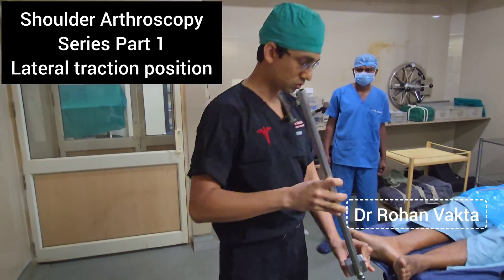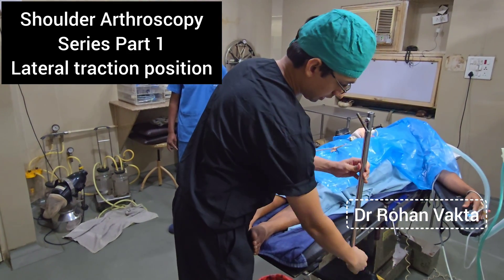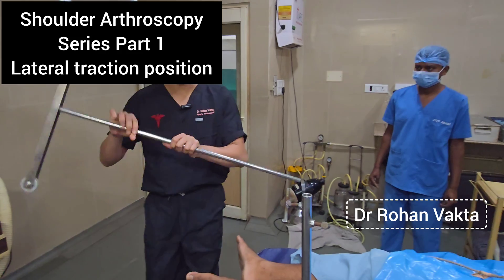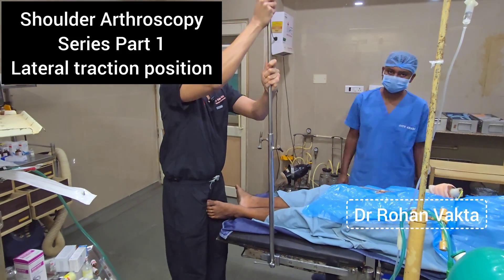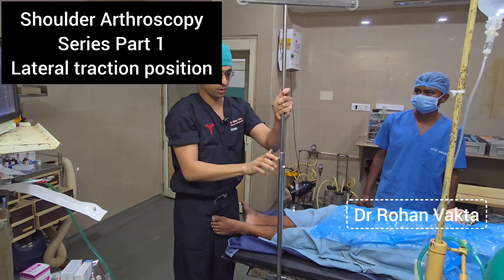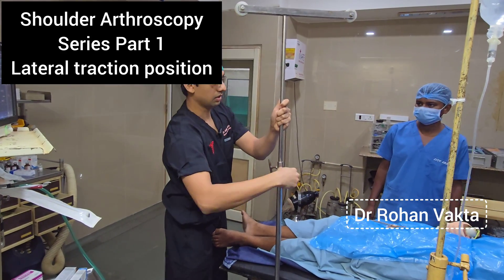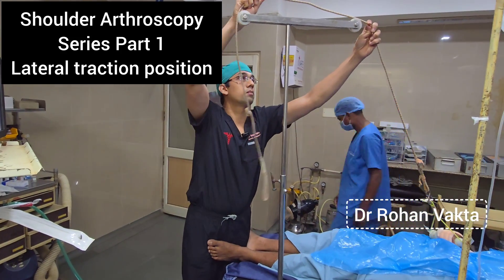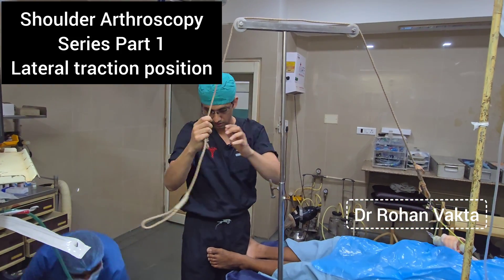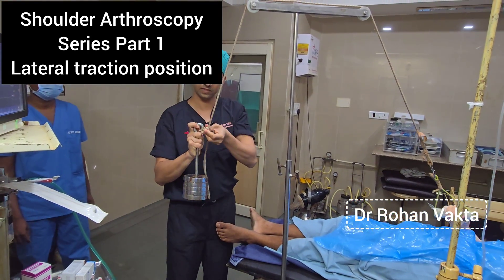There is a clamp which will attach to any surgical table — it is a universal size — and we lock it here. This is the second unit by which we can adjust the height. This is the optimum height and we tighten it. The thread runs over two pulleys here, and then we attach around 4 kg of weight.